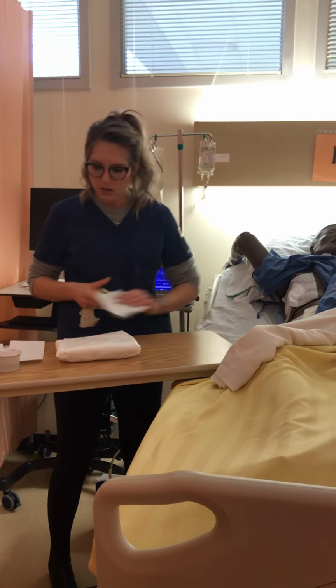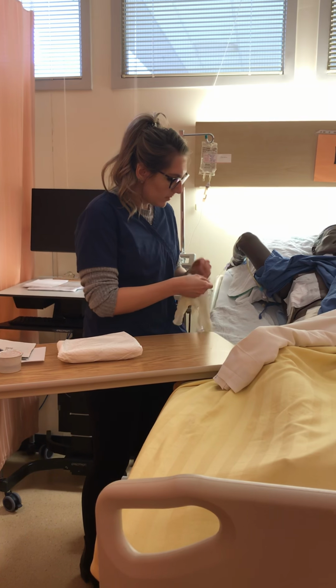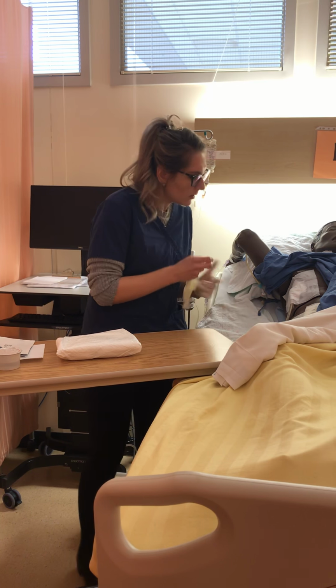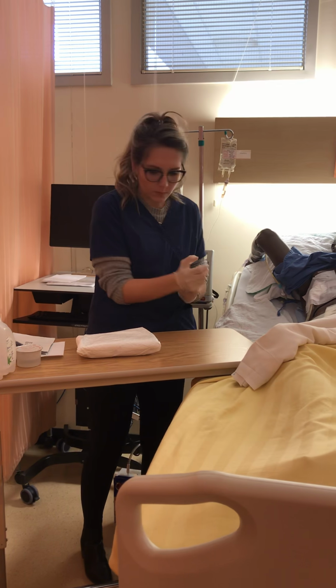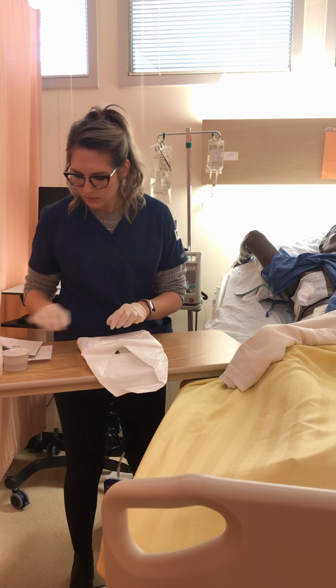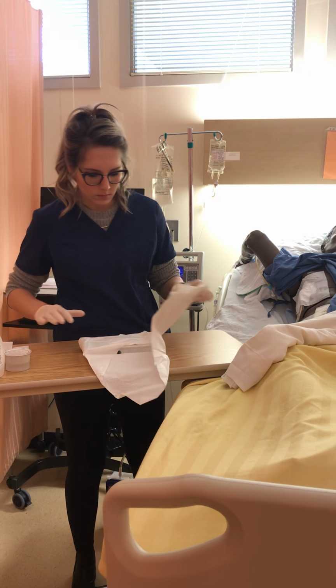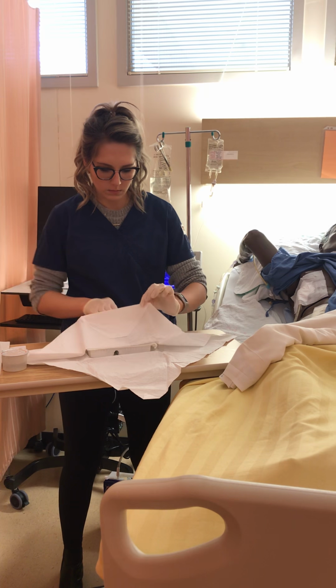Okay, so I'm going to start by just removing this dressing. Okay, and then I have my Jelonet. And I want to be pretty quick because that air seal on there, the Jelonet, is what's causing it to seal. So I want to be quick when I remove that. So I'm just going to set up my sterile field now. A little slippery.